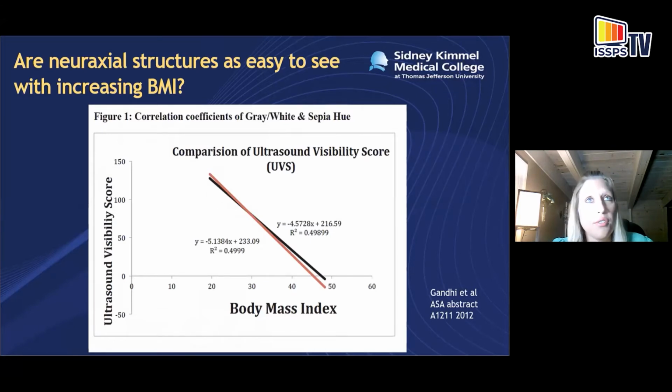And it's all likely due to the increased attenuation as the ultrasound beam travels a greater distance. It's likely too that the attenuation is exaggerated simply because of the irregularity of the adipose tissue, resulting in a lot of scattering of the ultrasound beam. And there's going to be a lot of reflection as well at the muscle-adipose tissue interface. So not all of the ultrasound beam is going to be able to penetrate down to the structures. So all of this will degrade the image.